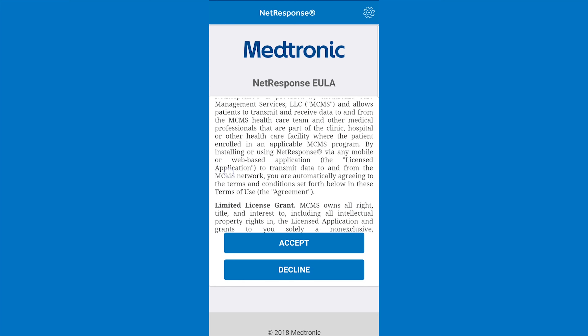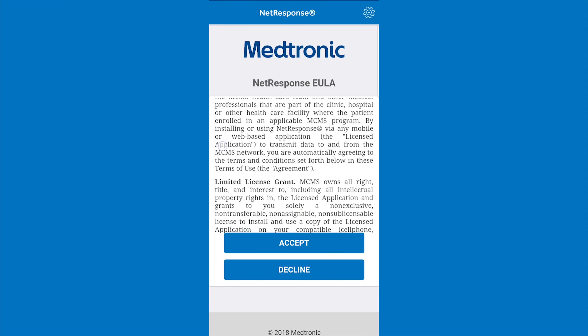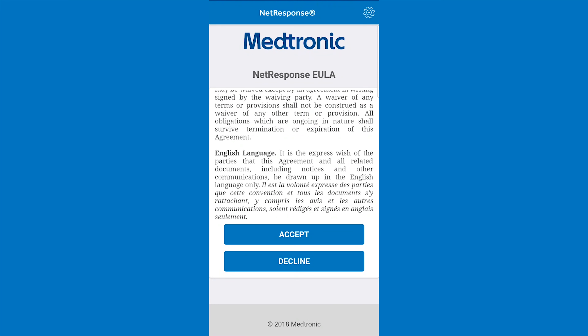If you are logging into the NetResponse application for the first time, you will see the Terms of Use statement. After reading through the Terms, select Accept. If you choose to decline, you will be sent back to the login screen and will not be able to use NetResponse.